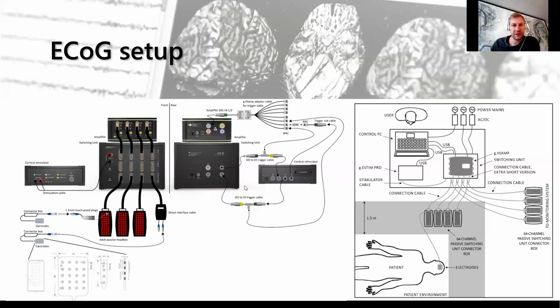And on the backside, there can be more cables, especially when we need to propagate triggers through the devices and trigger them externally. So it's possible, for example, to read external behavioral triggers. For example, when there is a microphone threshold, when there is a push button trigger information, we can read this TTL information into the amplifier, and by that synchronize the external protocol with the raw data.